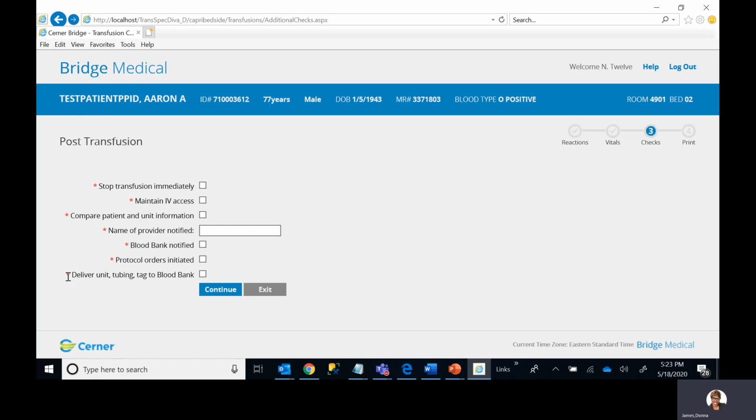This is also an area of design. I'd like you to pause this video to discuss what should be your post-transfusion reactions. Again, leverage the use of your policies and procedures to help guide you in the verbiage of your statements. The nurse will document all the steps that have taken place.